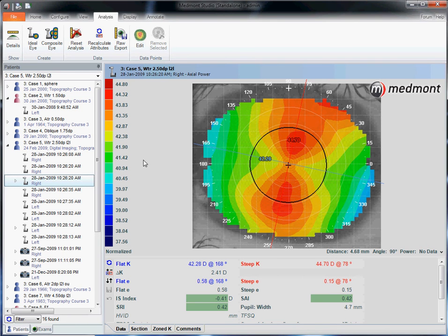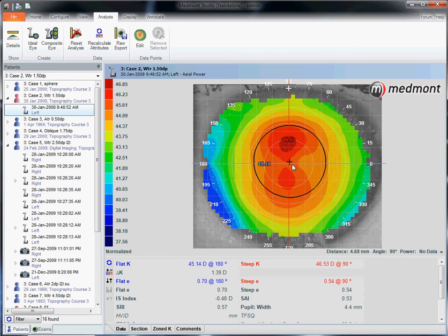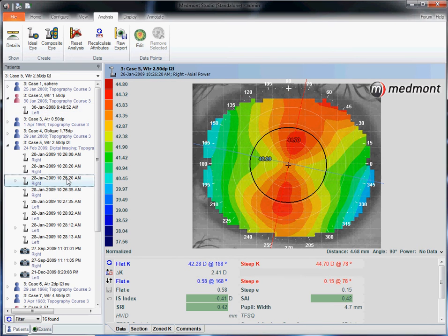So your apical astigmatism is a much easier case in orthokeratology. Your limbus to limbus is more challenging for peripheral fit, and more challenging refractively to eliminate the central corneal astigmatism.